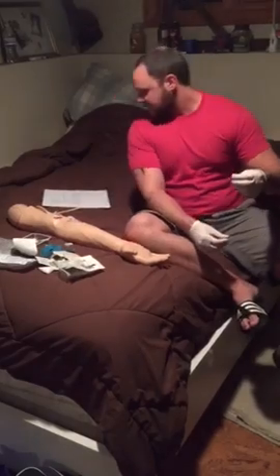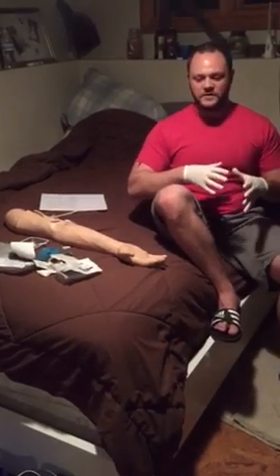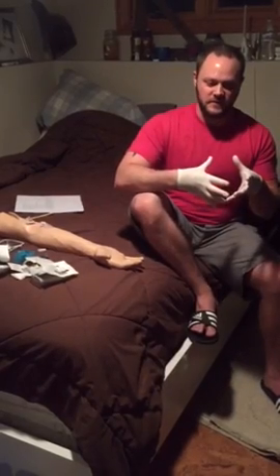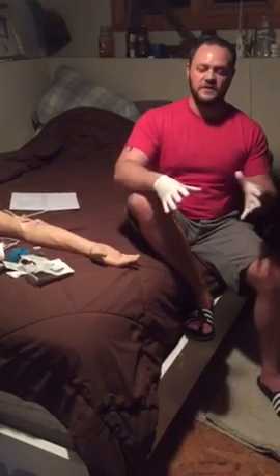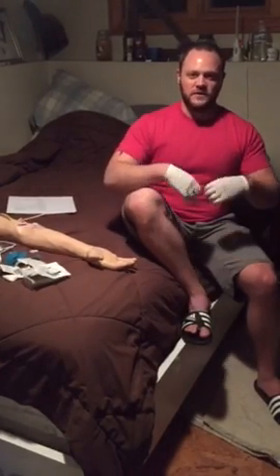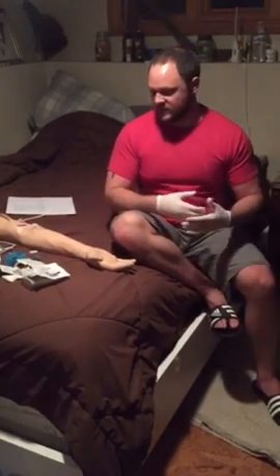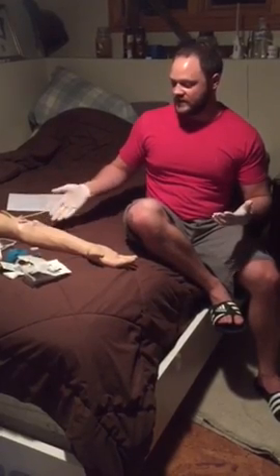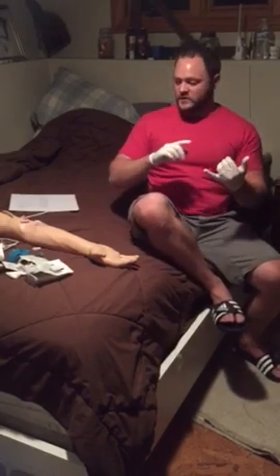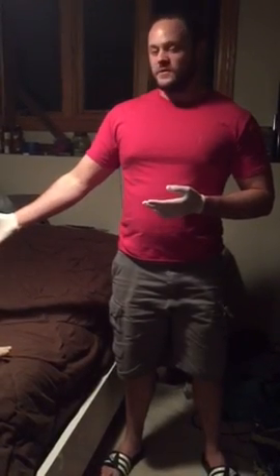So the scenario I gave in the beginning, that was an actual scenario that I saw, and the patient was completely freaked out, didn't know what to do. So I had to help my coworker alleviate the situation. The situation could have been avoided completely had these steps been followed properly. So in this speech we've gone over who needs an IV, the supplies needed to start an IV, and the proper steps, and then we've demonstrated those steps right here.